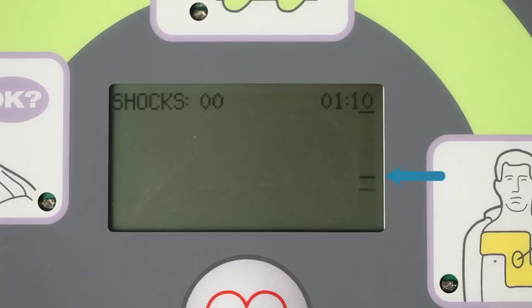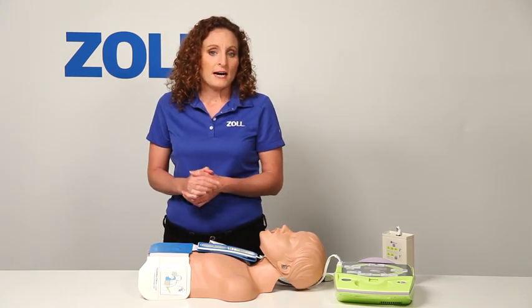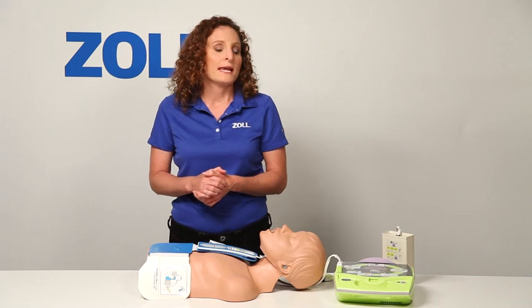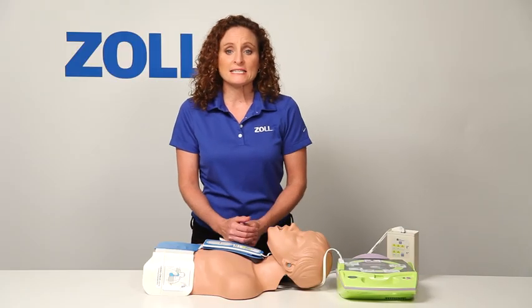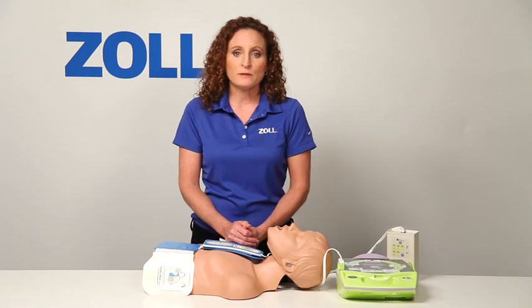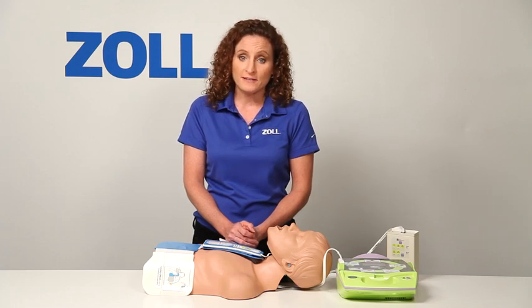The upper line represents 2 inches, while the lower line represents 2.4 inches. When you do good compressions, the bar should at least cross the upper line. Now if I stop CPR before the AED Plus tells me to, Real CPR Help continues watching for my compressions. After 10 seconds with no compressions, it will prompt me again. Continue CPR. So when it's time to do CPR, the AED Plus can see my chest compressions, tell me to push harder when my compressions aren't deep enough, and I can see the effectiveness of each compression by watching the real-time feedback of the bar gauge.